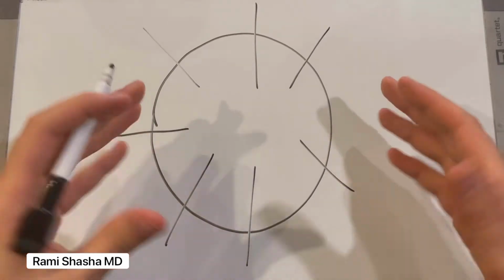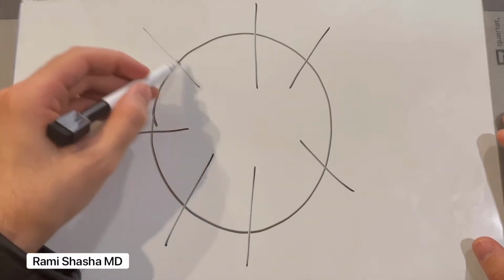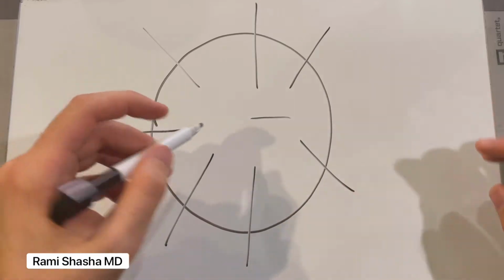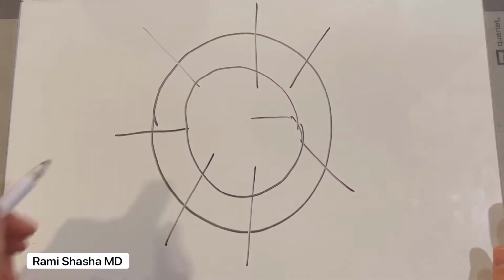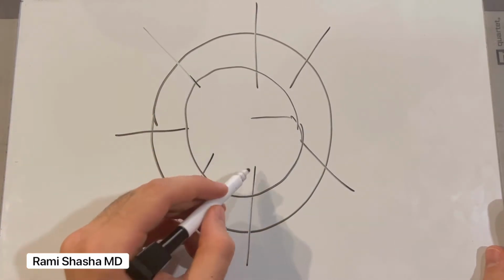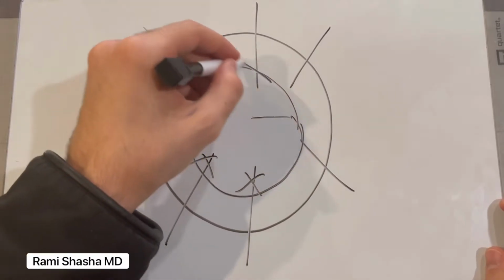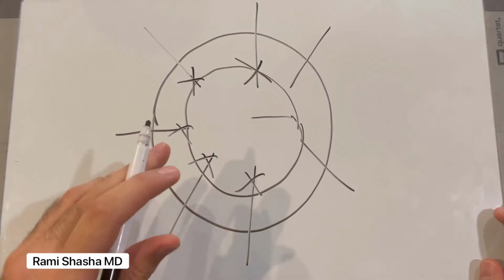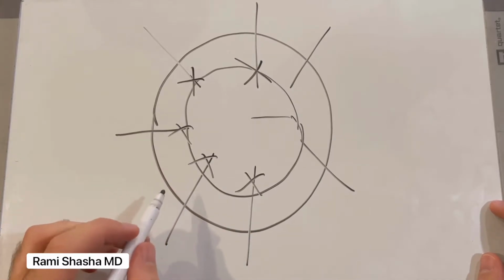Well, again, you're going to notice it here because I'm using a marker, but in routine surgery, these zonules are very thin. So the surgeon will start the capsulorhexis, and I'm just going to pretend like the surgeon's completely oblivious to the insertion sites of these zonules. Well, as the surgeon was making the capsulorhexis, he or she was in the process stripping away all these zonules. Now, usually with this condition, there could be a few fibers or there can be many. And as you're stripping fibers, you're going to induce zonulopathy.